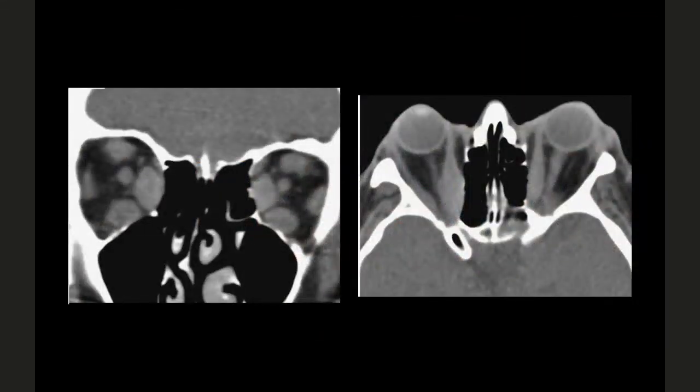Case two. What modality is this? It's a CT. Okay. So the medial rectus tumor. Medial rectus, okay. First of all, don't use the word tumor randomly, because we use the word lesion and the word mass differently. This is the reason, because the Coke bottle one is also not a tumor, and the other one is also not a tumor technically, right? So we are going to say enlargement or something like that. Enlarged medial rectus muscle, right?